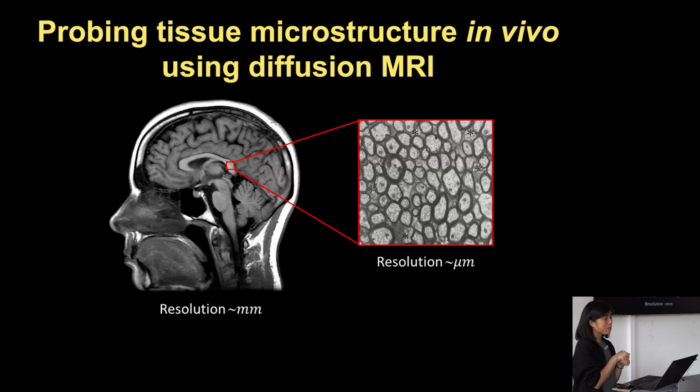I think the fundamental methods that we're advancing with the Connectome 2 scanner is really diffusion MRI. I would argue that diffusion MRI, amongst all of the MRI imaging contrasts, holds a great deal of promise for being able to get information down to the tissue level, down to that microscopic level. We know that with MR, we are typically limited in terms of our spatial resolution to millimeters in size, and the nominal voxel size doesn't allow us to get really down to the microscopic level.